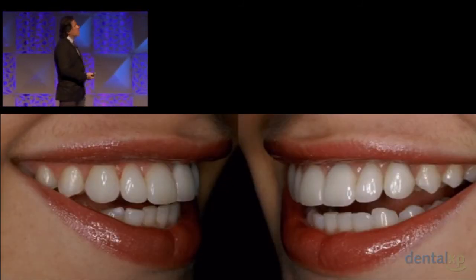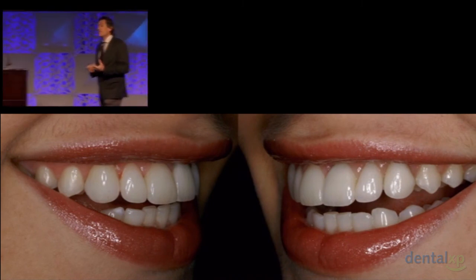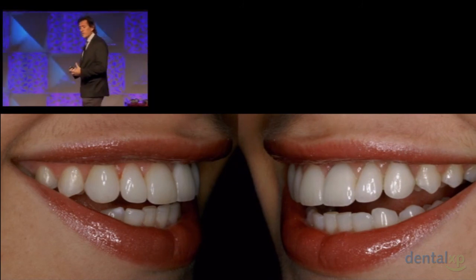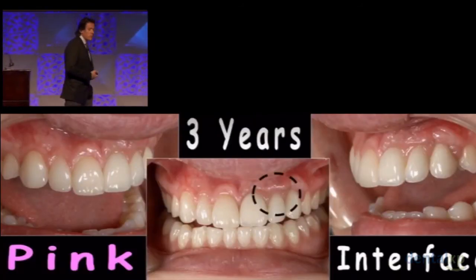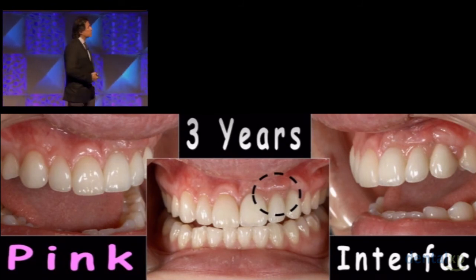And if we take a look at the way she looks today, you look at the left side versus the right side with some of these different artificial materials that we use, and certainly composite resins. This was Gradia from GC and a talented ceramist. We can actually achieve these kinds of results. And for a young lady like this, I don't want to promise more than I can achieve. So I want to start the process of building this into the equation. And we published a 3-part paper in Quintessence in the IJPRD of how we address those particular situations.